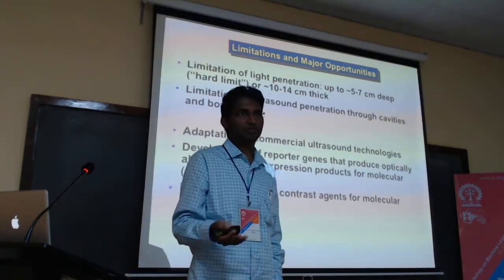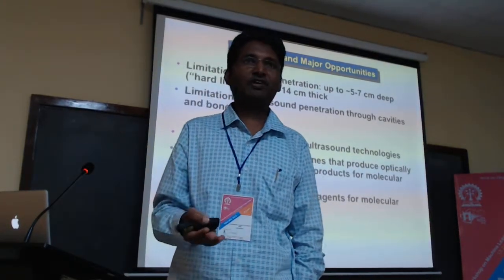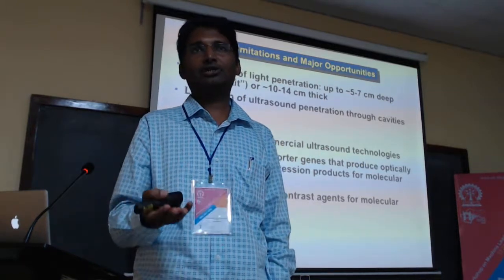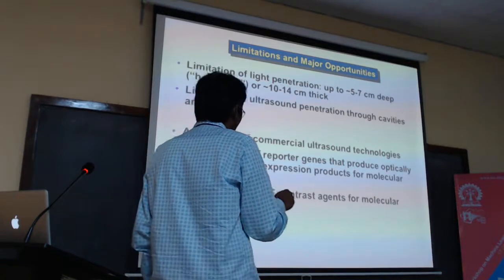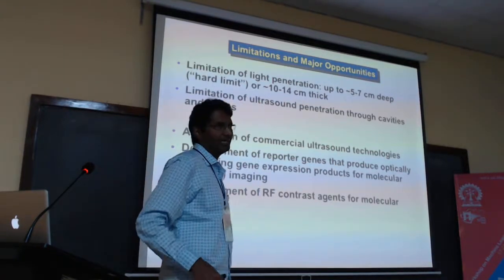Ultrasound also has the same issue. There is a shadow effect which happens. Similarly here, we cannot get through the cavities or bones. Now again, adaptation of the commercial ultrasound technologies has not really happened, right?